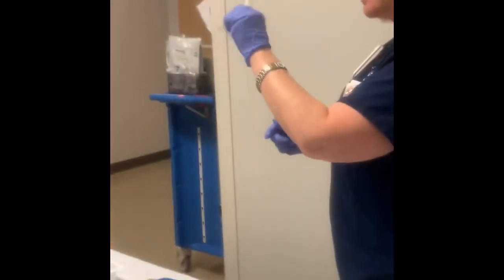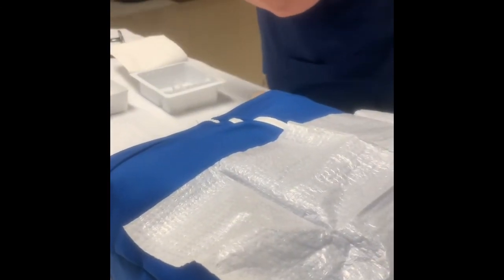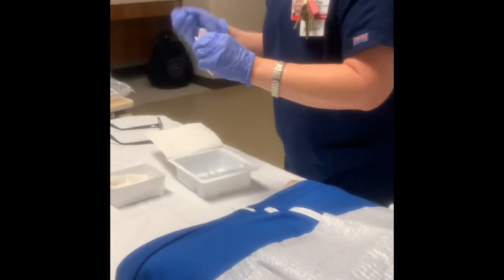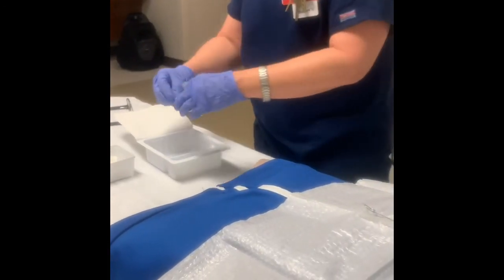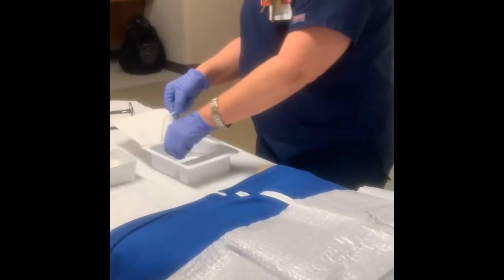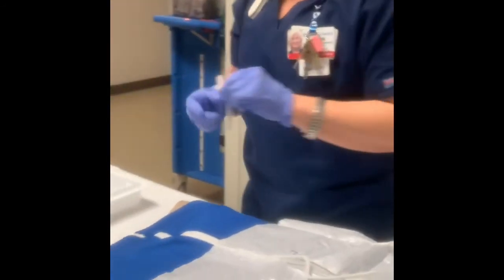If it's disposable, which almost all of them are nowadays, dispose of it and get a new one. If they are not, you're going to have to put it in here and use your pipe cleaner to clean your inner cannula, okay? I don't like to put it back here. Some nurses do that, but I don't like to. I'll just throw it in my discards here. You've also got some more pipe cleaners right here that you can use. I'll dip it again and use my pipe cleaner again to clean it, okay? Then discard it, okay?